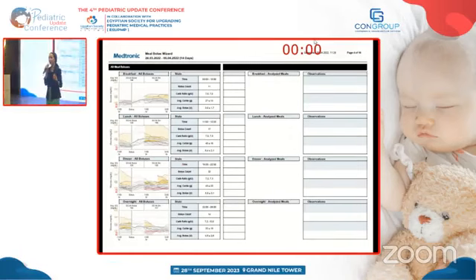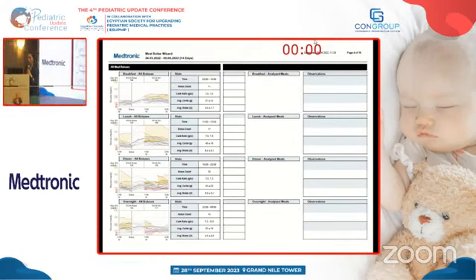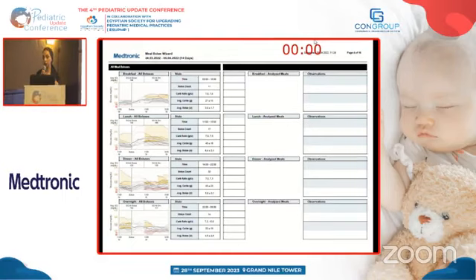أول حاجة الانونسمنت بتاع الميل بولس، وقته مظبوط ولا مش مظبوط، إنه بياخد فعلا الجرعة قبل الأكل ولا بياخد ديورينج ولا بياخد بعد. تاني حاجة بيقولها لي كمان إيه الأخبار اللي بتحصل، بيقارن الريدنج بتاعتي بيفور الميل بولس وبعدها، فأقدر أحكم برضو هنا على الكارب ريشيو أو الكارب كاونتنج في البيشنت بتاعي. فهنا فور اكزامبل البريكفاست قبلها بساعة جايب إن الدنيا ستيبل، بعدها بيبدأ يحصل سلايت إنكريز في البي جي ليفل، ساعتها هنا أي مين كونسيدر إني أبص على الكارب ريشيو بتاعي وطبعا الكارب كاونتنج.